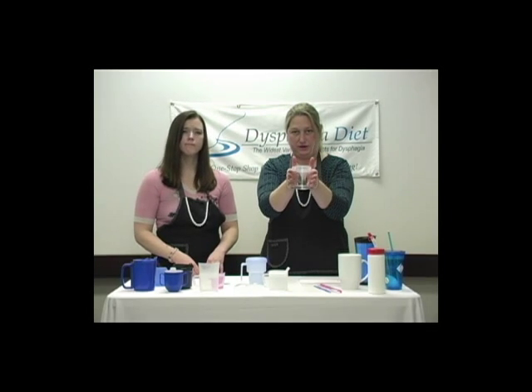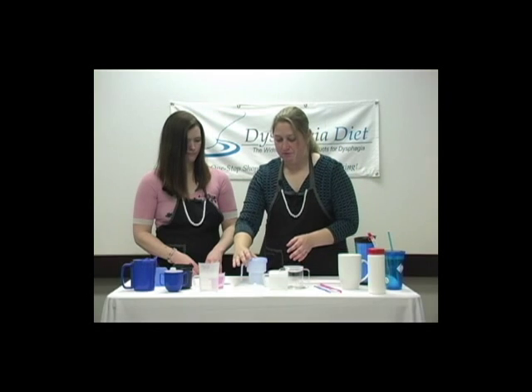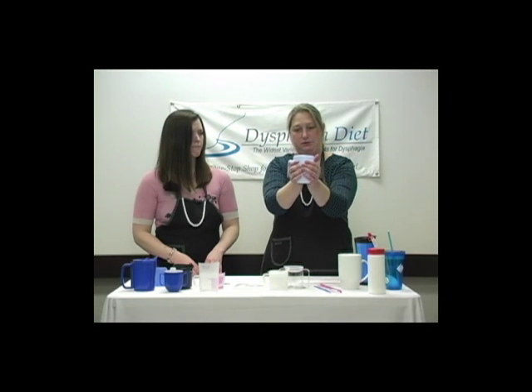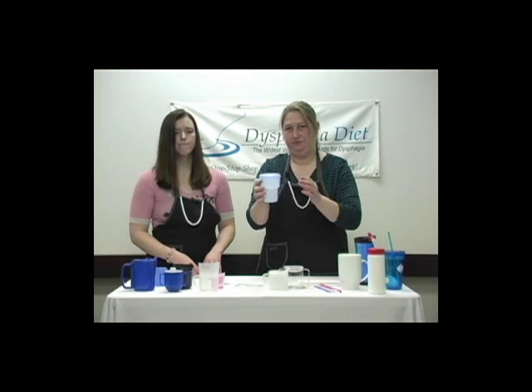Even without using that range of motion with your fingers. And another mug with an open handle, it's going to do the same thing. You can grasp with both hands, but then you also have the extra stability of the handle here.